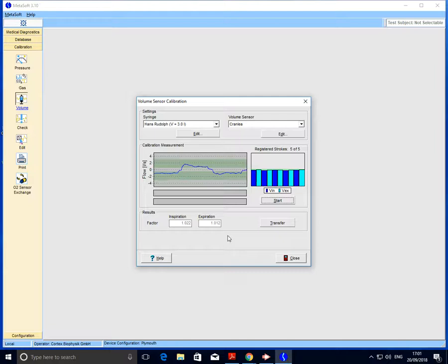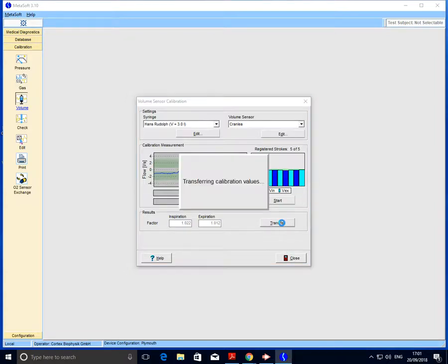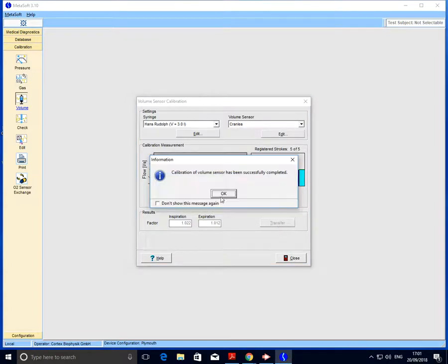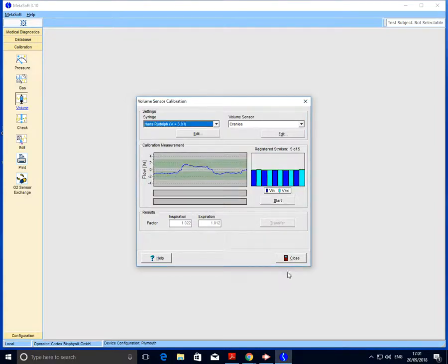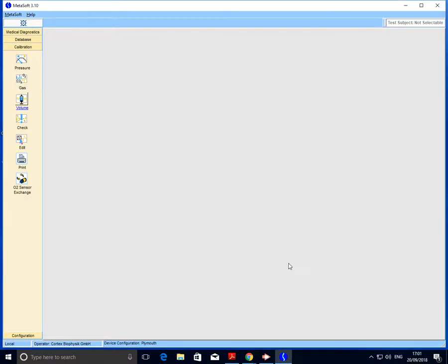Okay, so we've got our five registered strokes. That's the part of the calibration that might take a little bit of practice. I can now go ahead and select transfer, okay, and close.